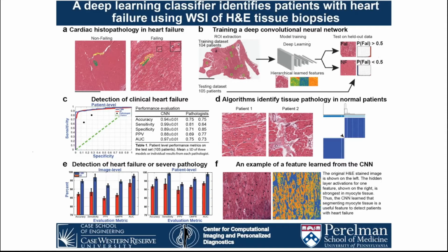This really stumped us because we could not understand how patients from the same institution, basically the same demographics, the same slide scanner, the same lab, where really there shouldn't have been any variation at all, how could the network that had already been validated on one tranche perform so badly, or relatively badly, on the second tranche?